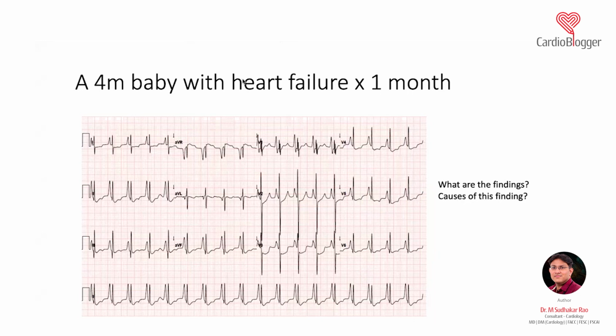What I'm going through in the next ECGs will be a repetition of what I did in the previous ECGs, and I can do a small revision in the last 15 minutes. Whatever I told you is related to your previous classes and axis determination, which is the most important thing. I'll try to do a revision at the end.